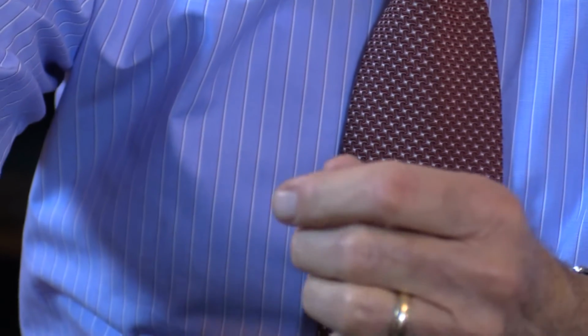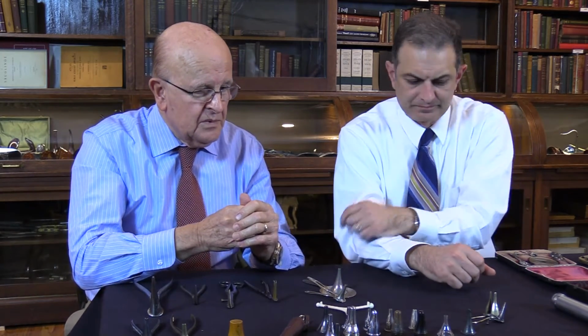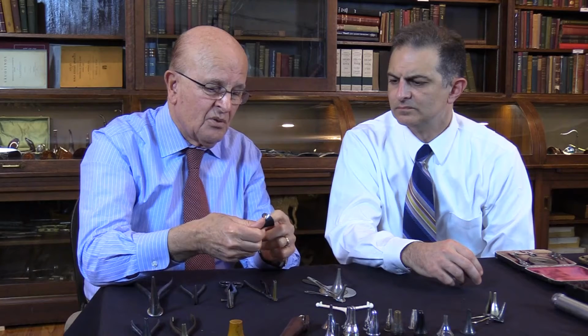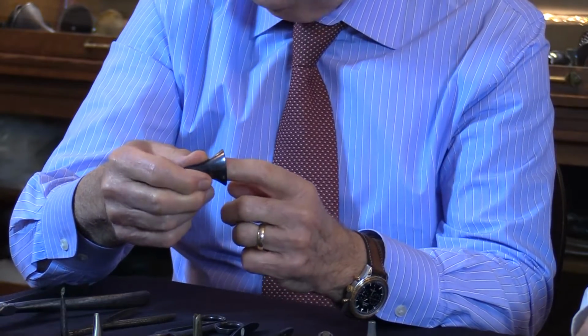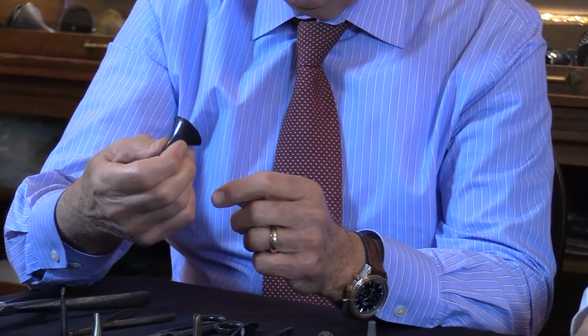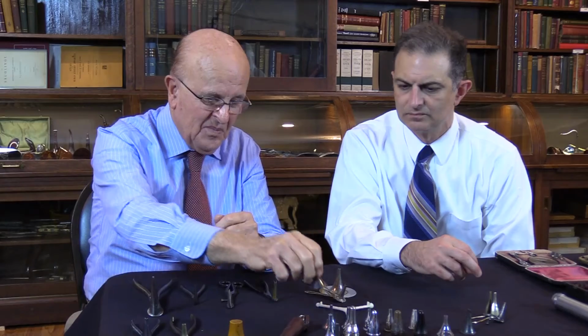So Politzer wanted to put his name on this, so he got the Hartmann, removed the rim, and it's Politzer's ear speculum. Do you think the Politzer had no rim because it was not attached to a handheld device, and just held by hand? Absolutely, and Politzer was very worried about the reflection of the light. In fact, he painted some of his ear speculums inside with black, non-reflective material. And as you can see here, there's no shiny surface to reflect the light.